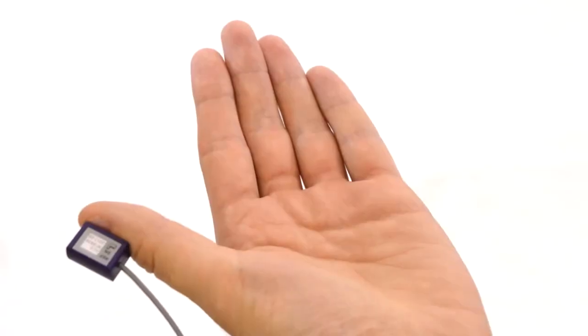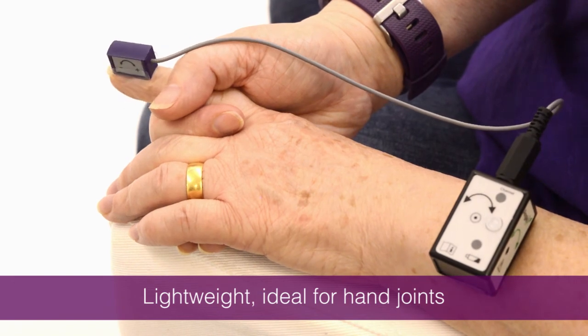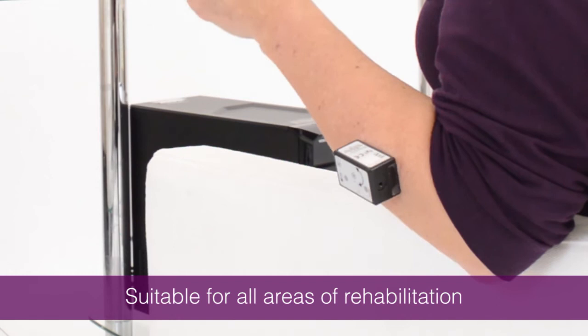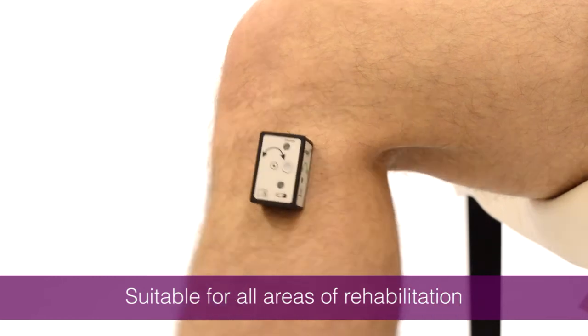The smaller sensor is lightweight and ideal for exercising each individual hand joint, perfect for patients with rheumatoid arthritis. The larger AngoX sensor is used for the forearm, elbow, shoulder, hip, knee and ankle joints, suiting all areas of rehabilitation.